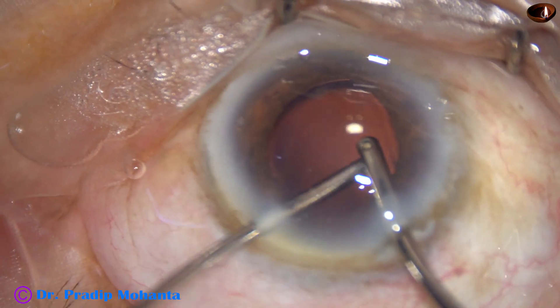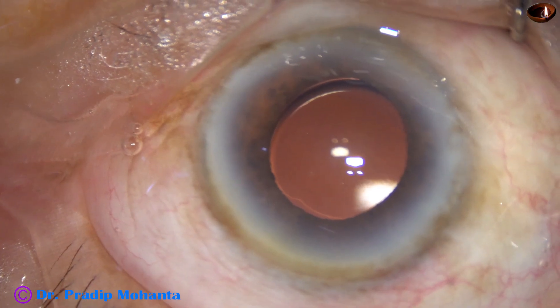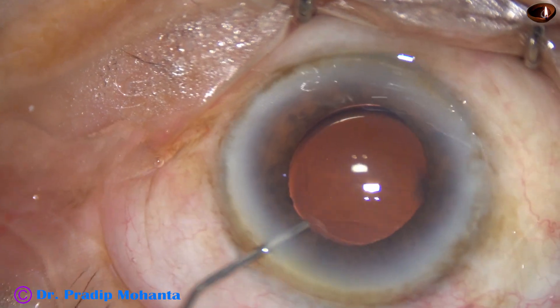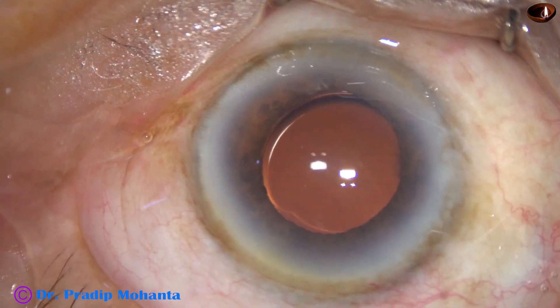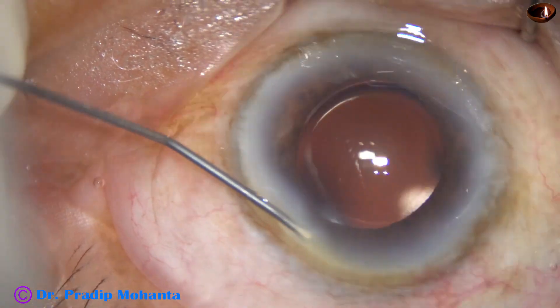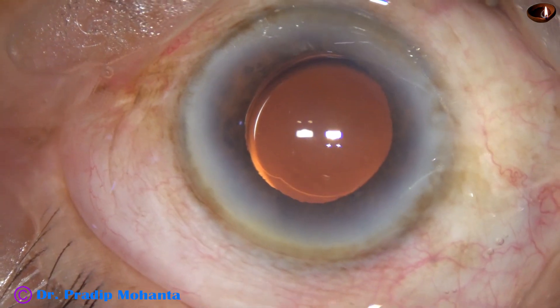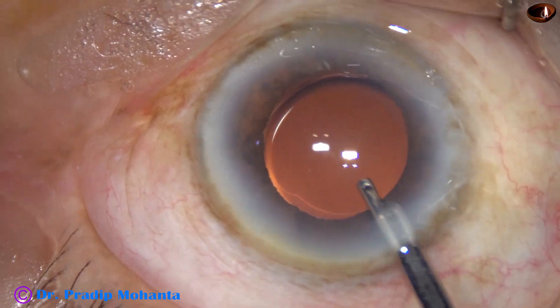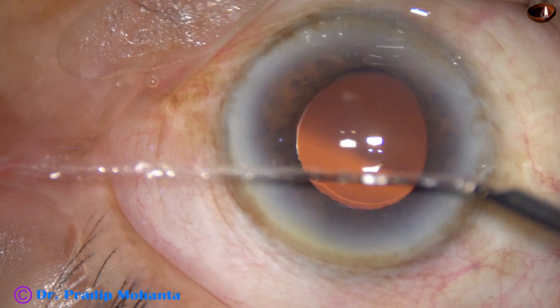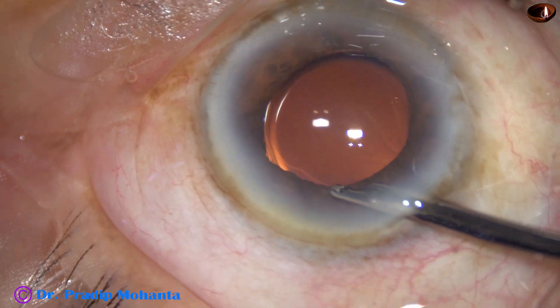It is done. Now I'm using irrigation and aspiration together to remove all the visco. I lift the anterior leaf of the main wound; leakage of fluid is minimal and it keeps the anterior chamber formed even when using the main wound. This is a bit of moxifloxacin. Now the side port is nicely closed by hydrating the corneal stroma on either side of the paracentesis wound. Then the final pressurization of the anterior chamber.